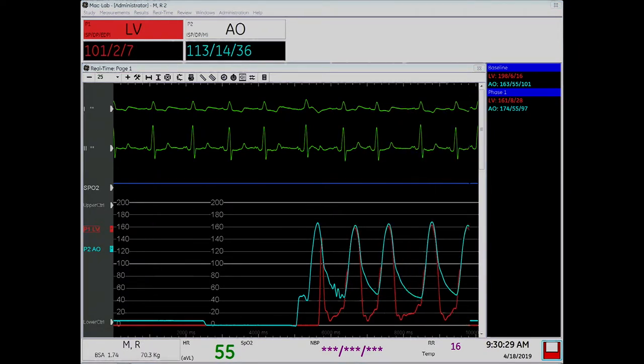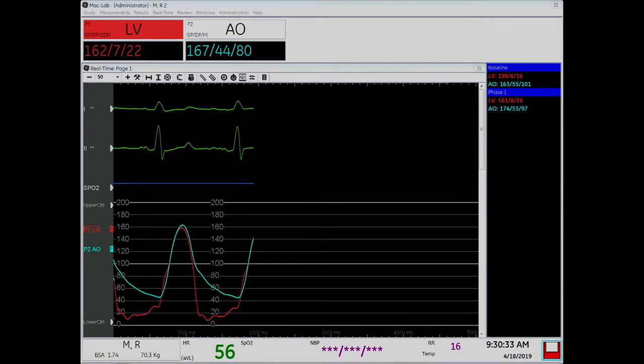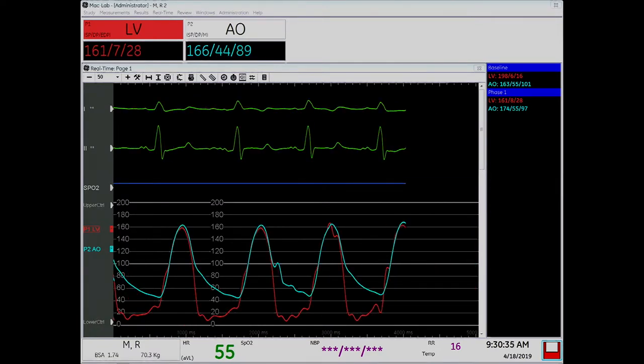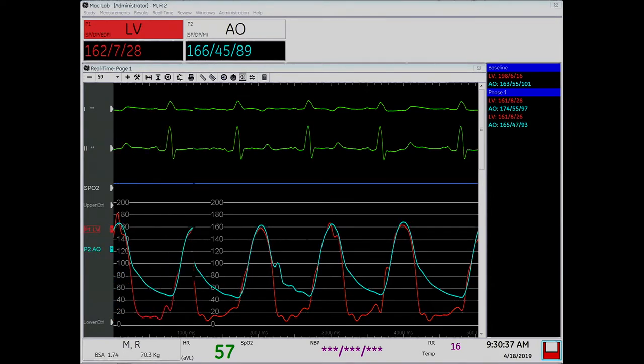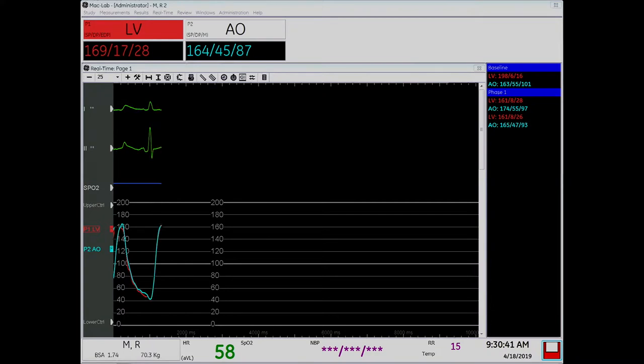But the problem now is that the regurgitation is more. And the heart rate is 56. All right, so let's pull this back and see. We may have to post-dilate this. Okay. So we'll give a couple of beats to let the valve leaflets get to know each other.